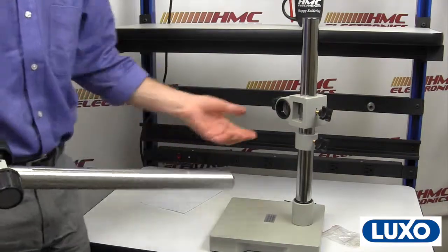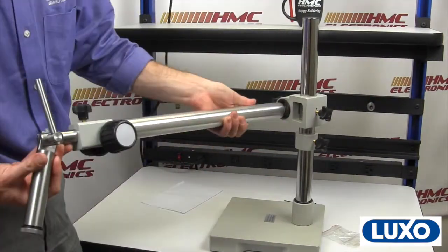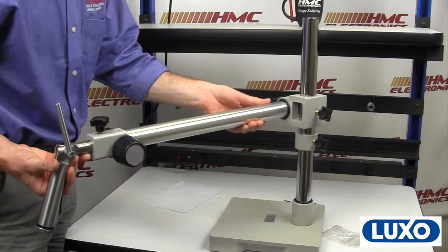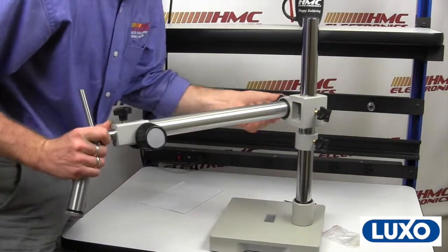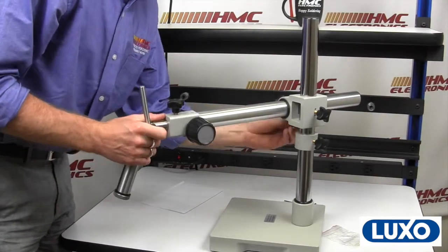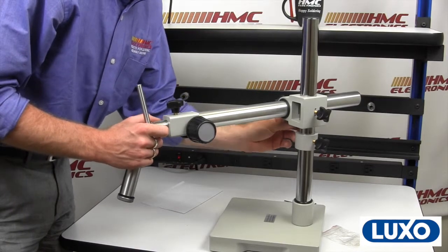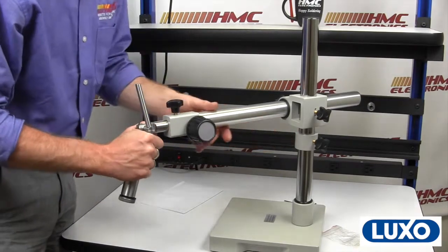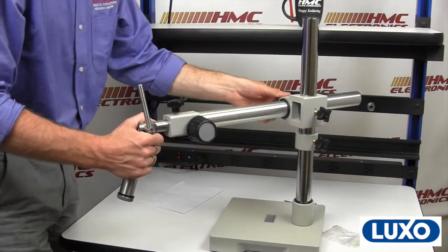Why does that little silver nut need to go on the bottom? There's a little groove right here. You push this in like so, and then that little threaded screw goes nicely into that groove, keeping everything nice and vertical and in place.